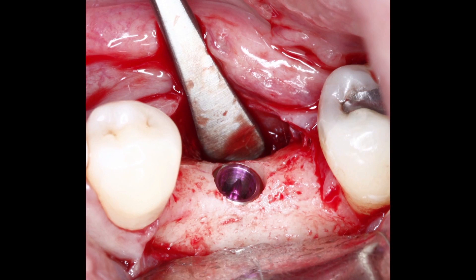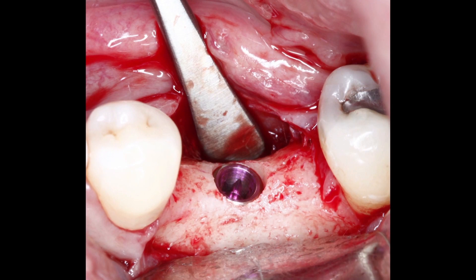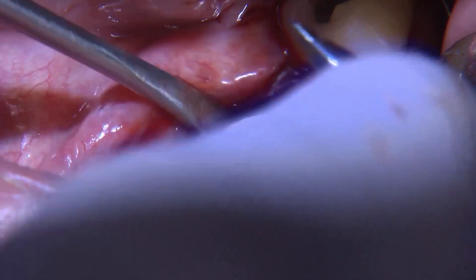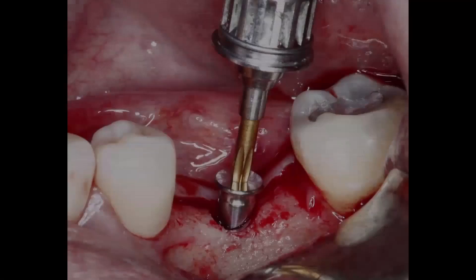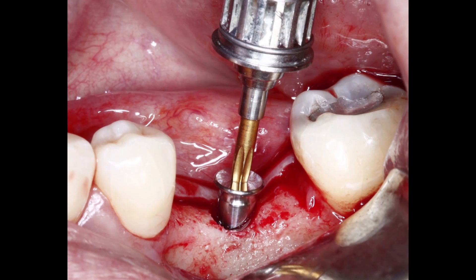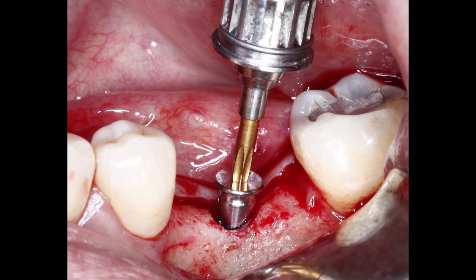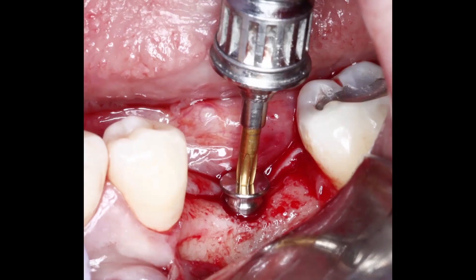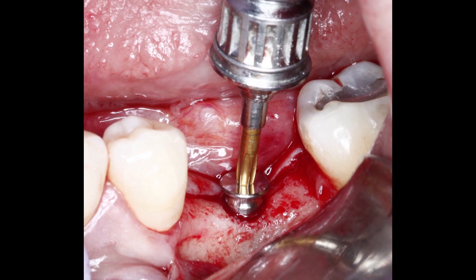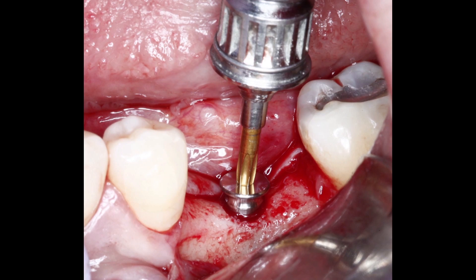Once the implant is in place, you can place a cover screw or a healing abutment. In this situation, I wanted to place a healing abutment that goes through the tissue. The tissue heals around it after I suture everything. Then, when I want to take the final impression, I can come back and remove the healing abutment, place my impression coping, and take the final impression.